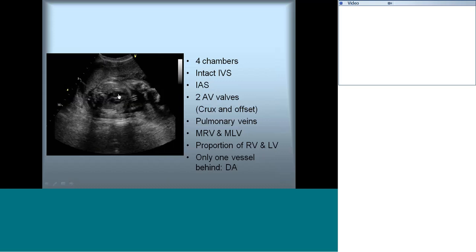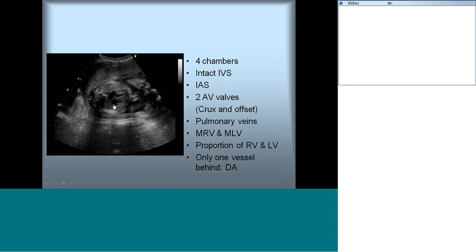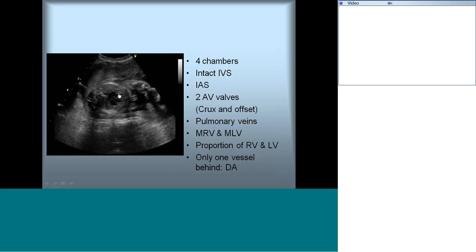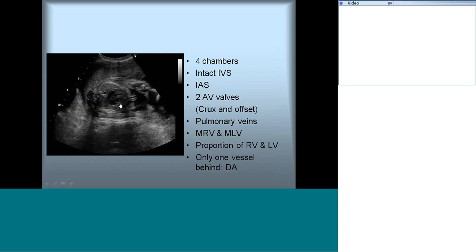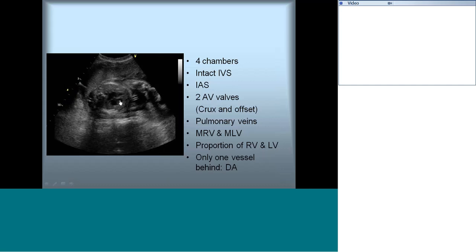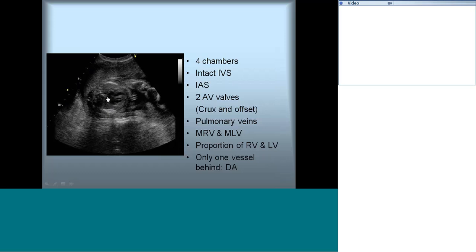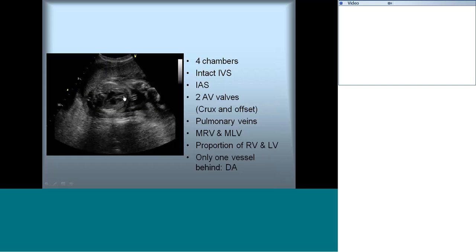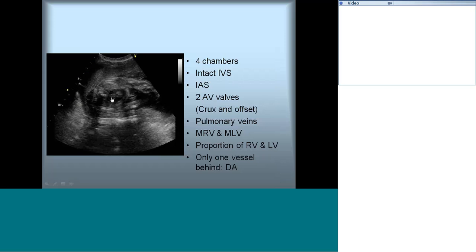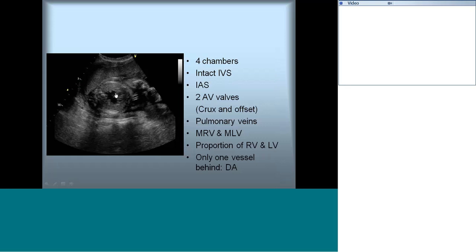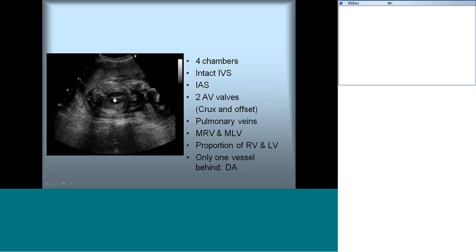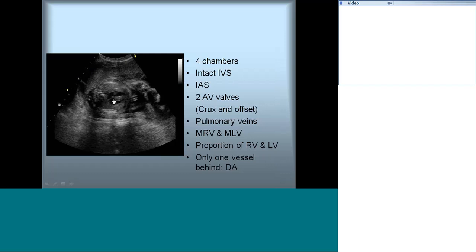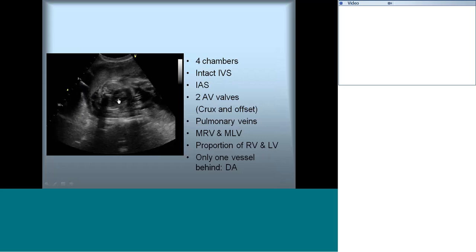Make sure the heart has four chambers and the proportions of the RV and LV are satisfactory. If in doubt, take absolute measurements of the chambers at the level of the leaflet tips during end-diastole using available charts. Confirm pulmonary veins entering the LA. The crux of the heart is important — check the interatrial septum, interventricular septum, and the septal leaflet of the AV valve. The offset between the tricuspid and mitral valve septal attachment is important; absence of offset should prompt evaluation for AV septal defects.